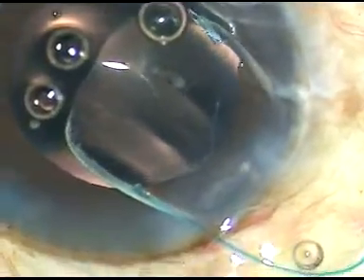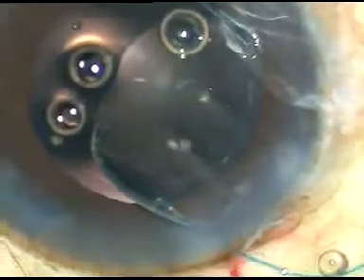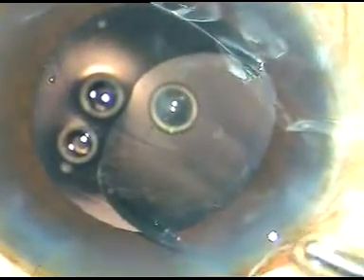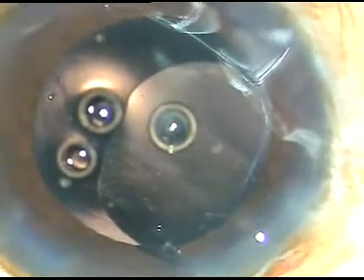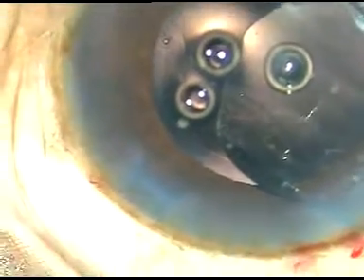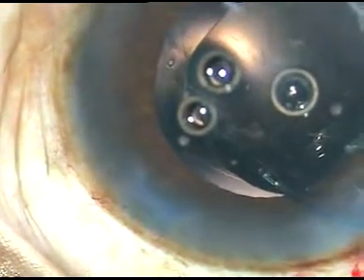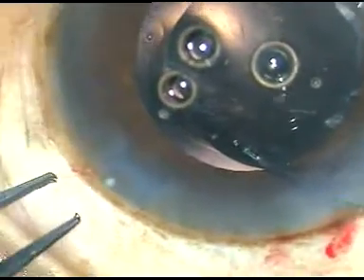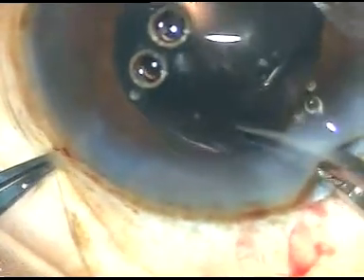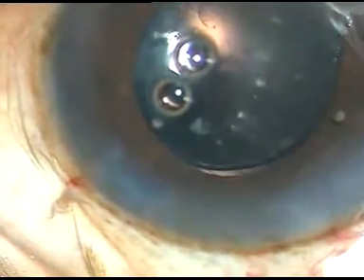The leading haptic has gone into the capsular bag. I inject a little bit of viscoelastic substance, make the AC deep, and now I hold the trailing haptic with a McPherson's forceps and see how I place it in the capsular bag. Here it is. It goes in the capsular bag.